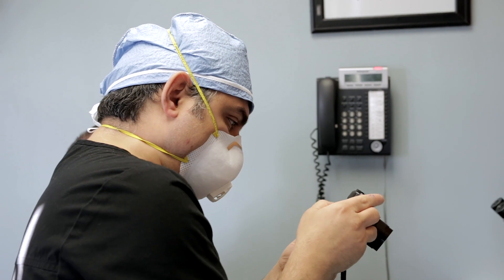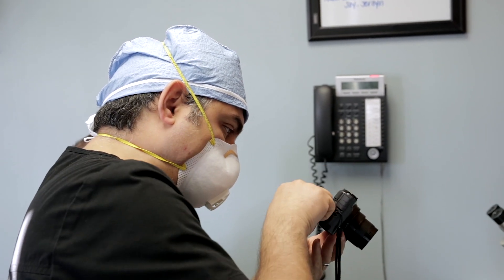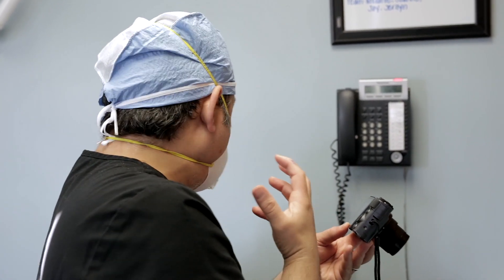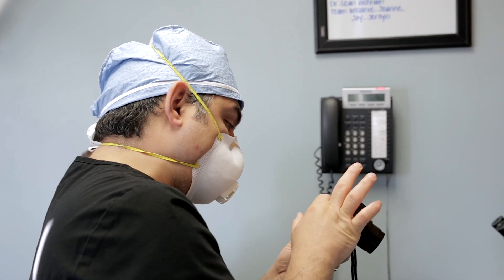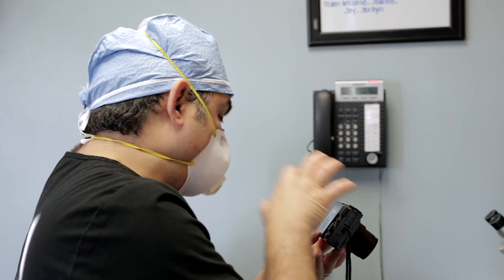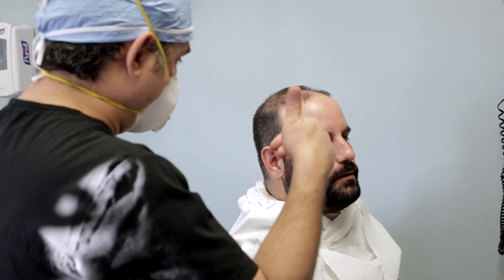When you look at the crown, there is a part that goes in a downward direction — you don't want to focus too much on that because it takes away from the volume. I'm going to put slight hairs going downward but the majority will be going upward, because whatever you put here gives you volume one centimeter down. That's important because you don't have an infinite number of grafts.